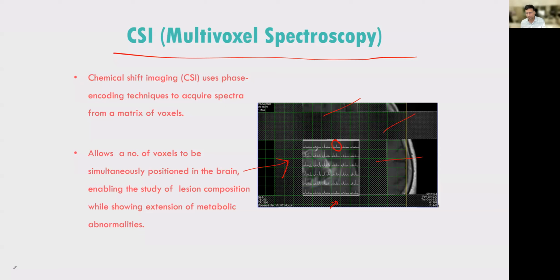And you are checking the tumor wall. You are seeing the center of the tumor. So by seeing this only, I'll know this will have normal spectra. This will have, maybe because it's in the wall, elevation of choline. Cellularity will be more. This is in the center, so there will be more of lipid lactate. That is how I look at the spectroscopy.